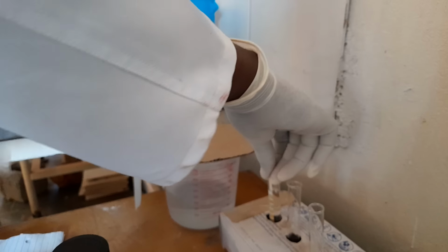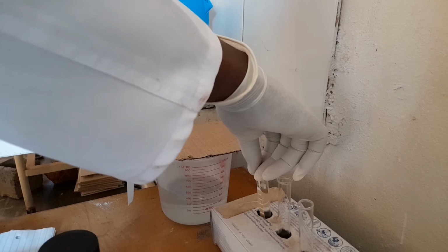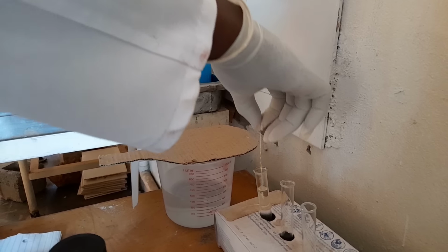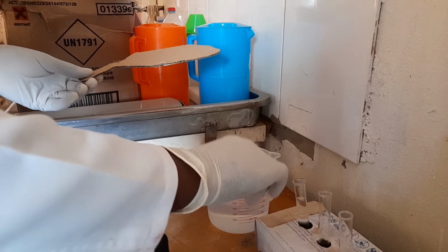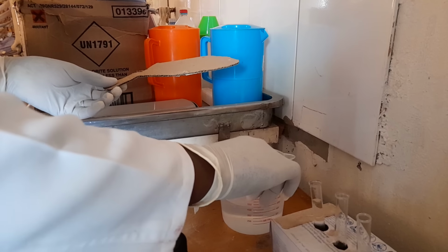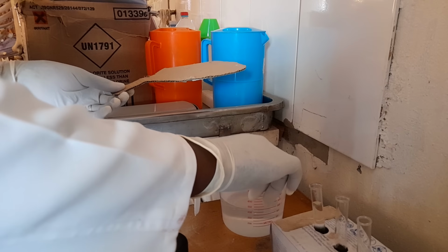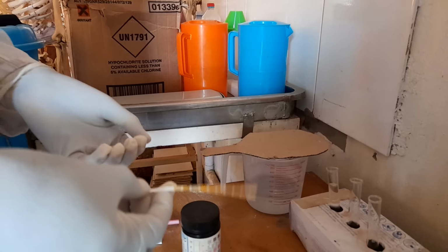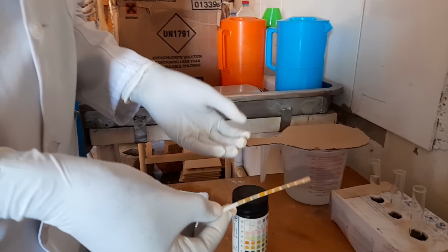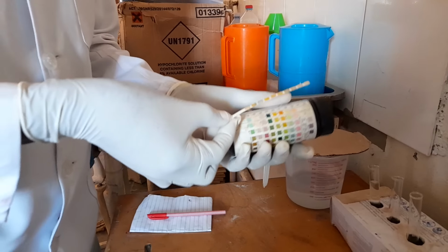You dip it down for 3 seconds, counting 1, 2, 3 in your heart, then you remove it. From there, you strike it there so that you remove excess urine. At this moment, you can get your nurse's watch and start timing yourself, comparing with the chart here.